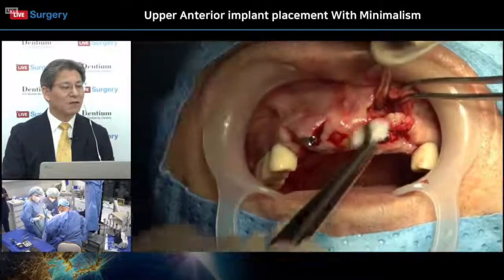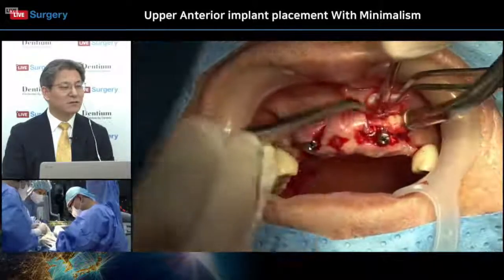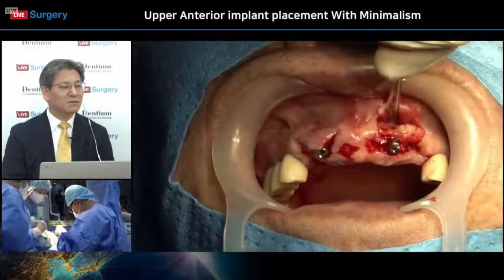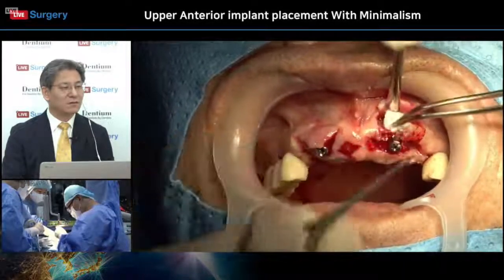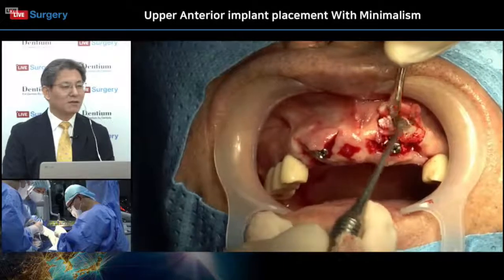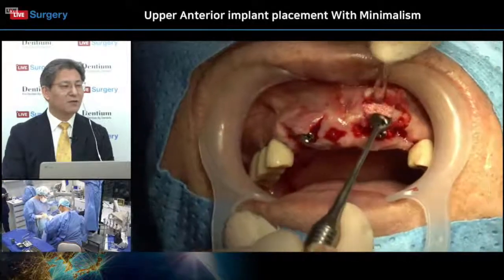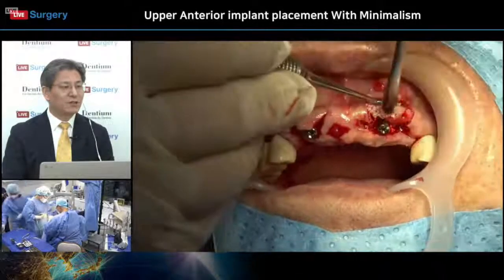Around the bone defect, maybe there is a concavity, and I'm a little bit worried about some resorption of the bone. Okay, so a little bit of Osteon 3 collagen graft with collagen graft coverage. The Osteon 3 collagen with collagen graft combination. This collagen graft is very nice and good biomaterial.